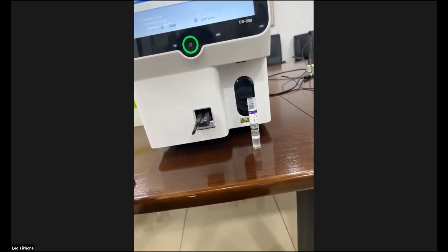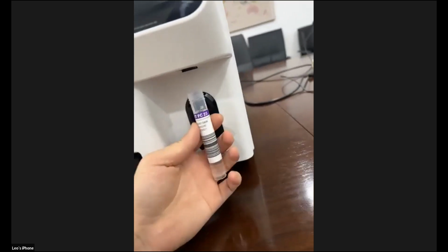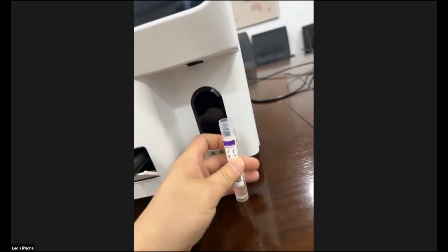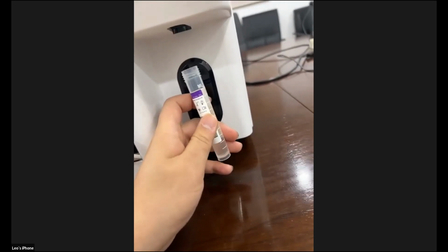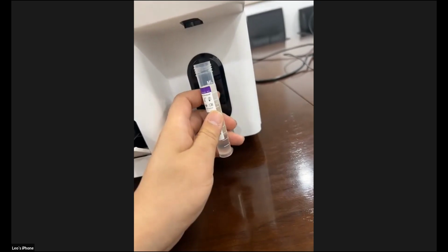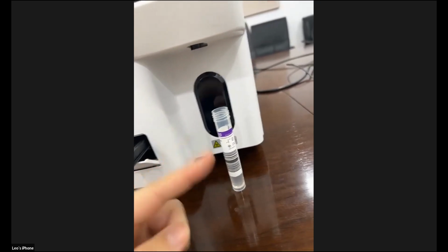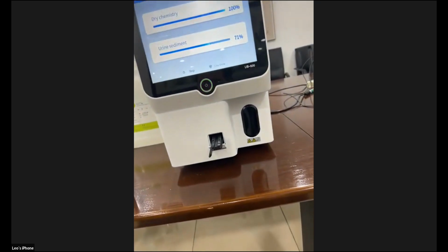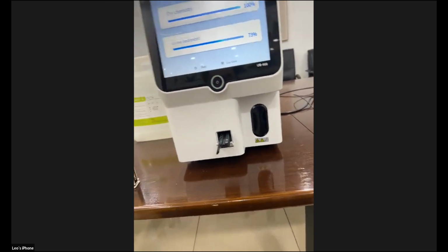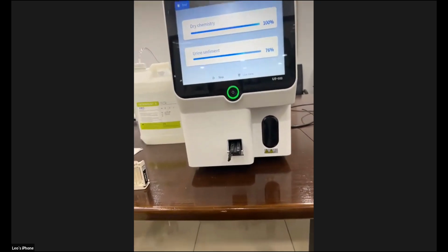So I think there will be a reference level of the probe. Because you can hold the tubes, you can adjust the level of the tubes and then finish the aspiration according to the probe position. Just make sure that the bottom of the probe is at the bottom of the tube. So I think it will be better. But for our SOP, the standard operation process is to ask our end user to mix the samples.